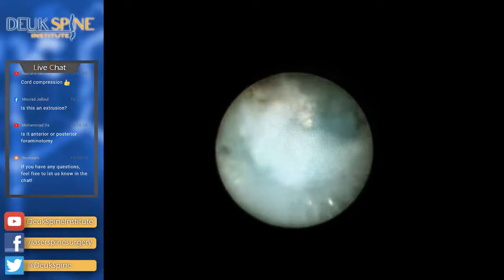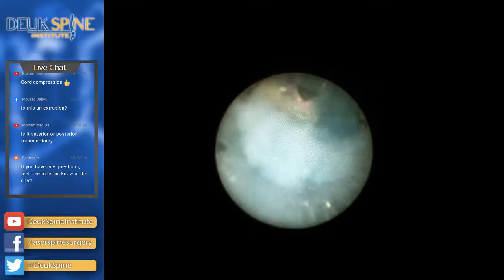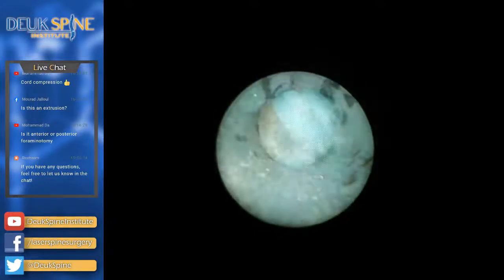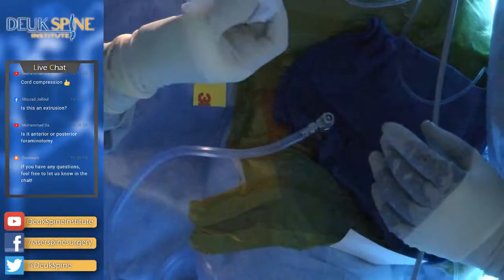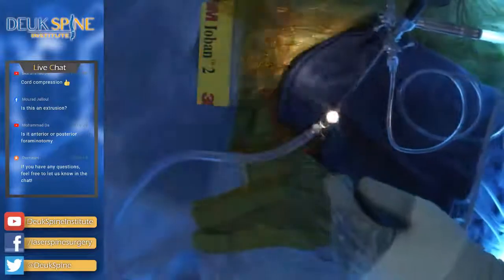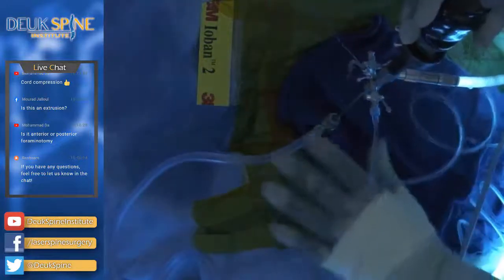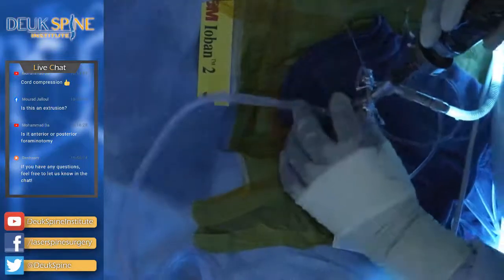And I'm very careful not to let the scope go forward and go into the spinal cord, which I know happened a few times in Korea. The Koreans are actually the first to do this procedure. They're the ones who taught me, but I know that they had some complications. Of course, they haven't told people about it, but that's exactly what happened. And they actually paralyzed a few people, which I've never done in 16 years of doing the surgery. But that's what happens when you keep your patients awake during the surgery and they're flopping around on the table.